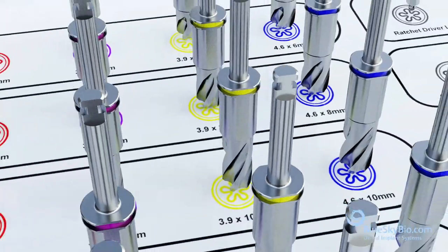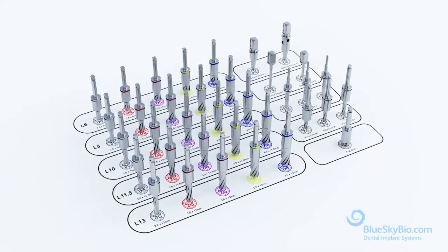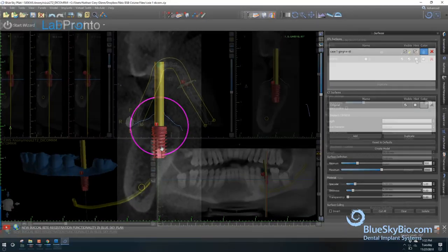The Blue Sky Bio fully guided keyless kit is a simple, ideal solution for guided surgery that offers maximal ease of access by eliminating surgical keys. Virtually position the implant in the best restorative and surgical position.